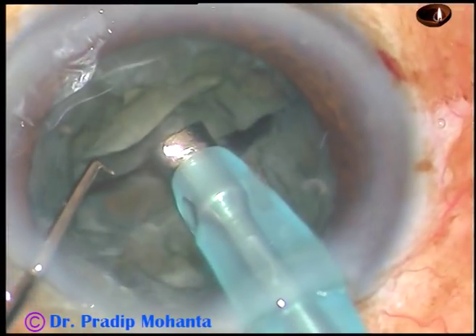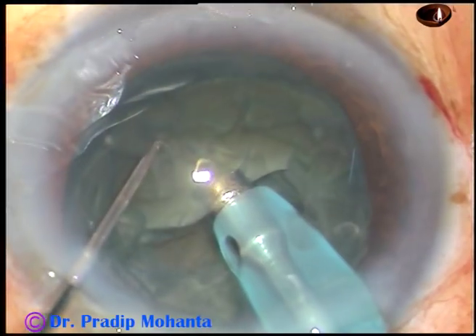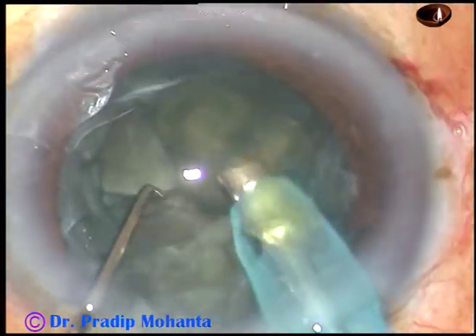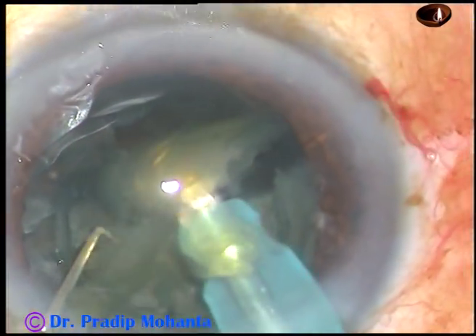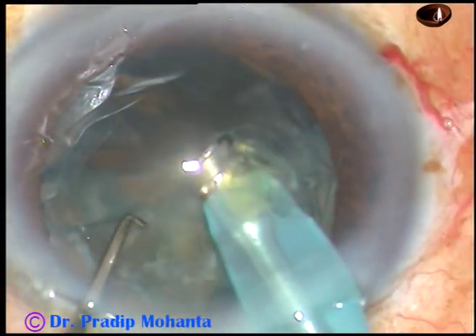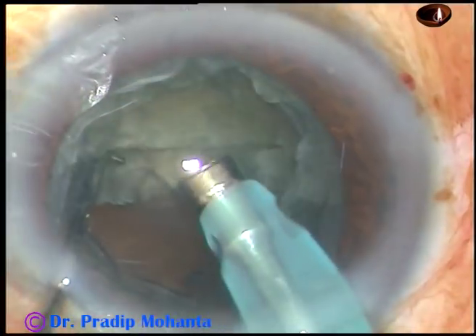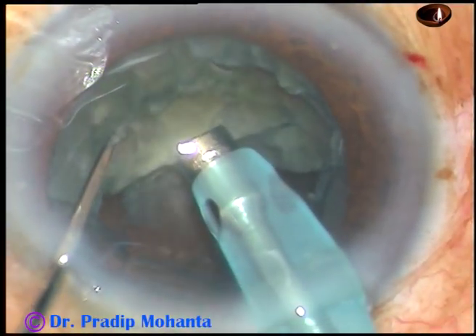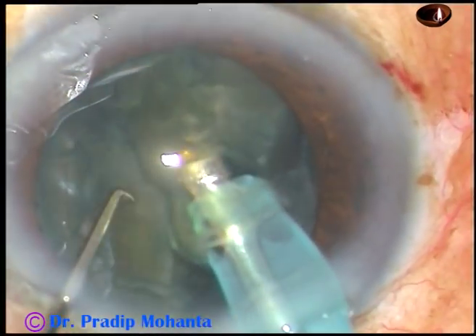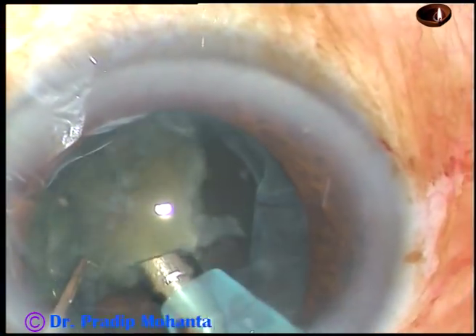Now go to phaco 2 mode. Till now you were in phaco 1 mode, where the phaco energy or the sonic energy was 60%, flow was 20, and vacuum was 60 mmHg. Now in phaco 2 mode, you are just holding the nuclear piece — that hemi-nucleus — and chopping it, and emulsifying each piece. Hold this hemi-nucleus at the center, chop it, divide it into two halves, and now each piece is emulsified and removed.